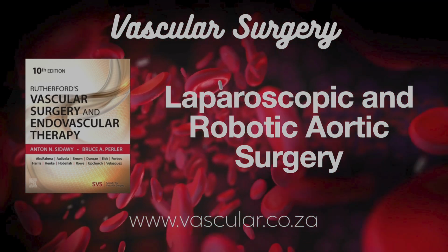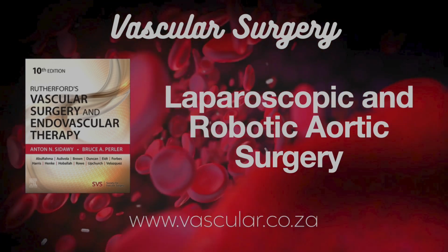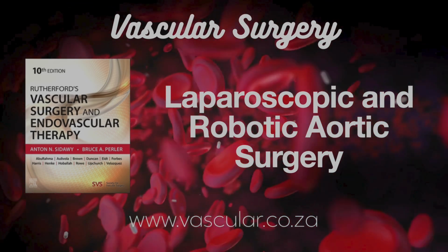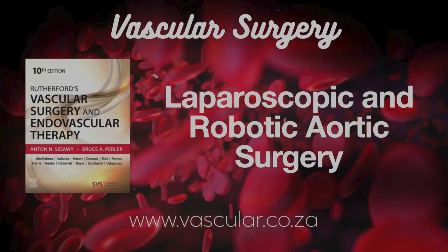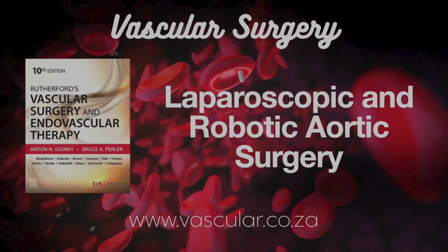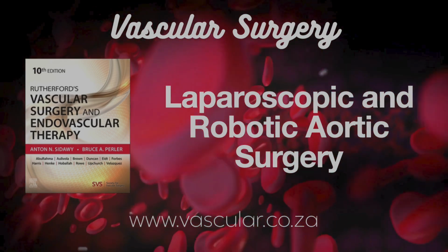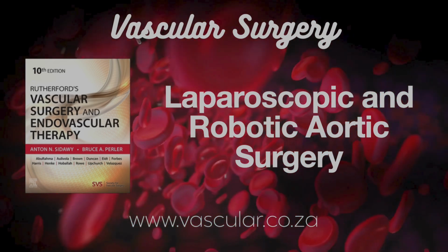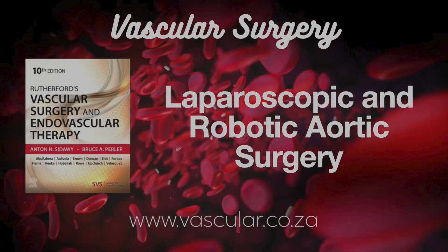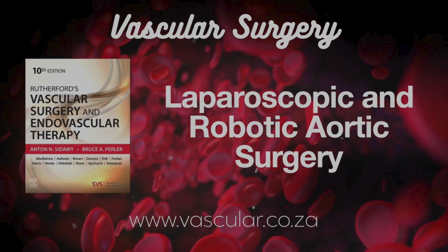Okay, circling back to the robot, how does it fit into overcoming those laparoscopic challenges? As we touched on, it directly addresses things like limited dexterity and 2D vision, that robotic wrist, the 3D view. It allows surgeons to do more complex maneuvers, finer dissections, maybe more easily than standard laparoscopy. Making the hard parts potentially easier. Potentially, yes. The book suggests it might offer durable solutions for things like iliac aneurysms without some risks of endoleaks or open incision hernias.